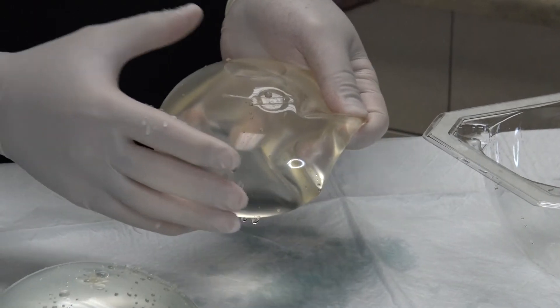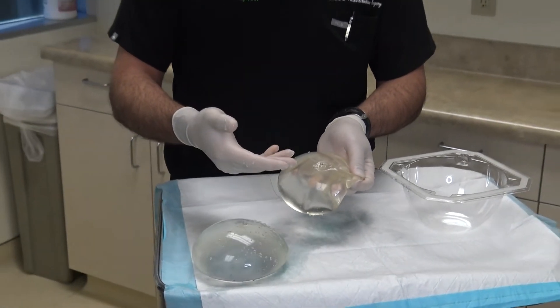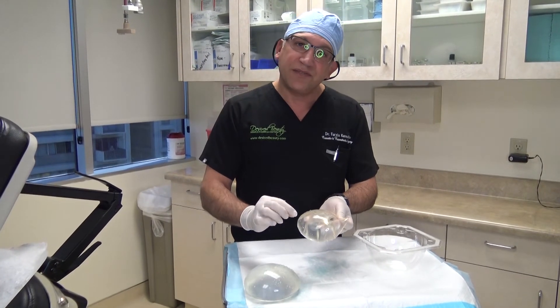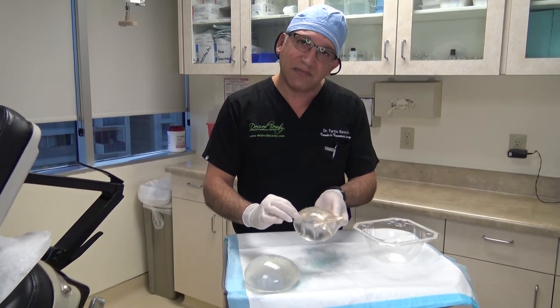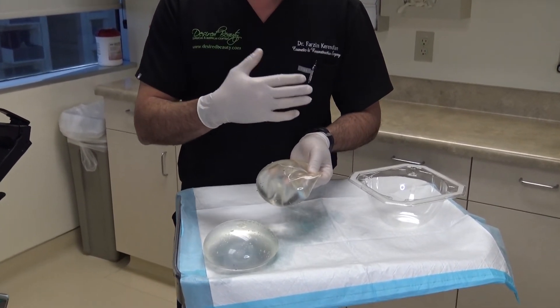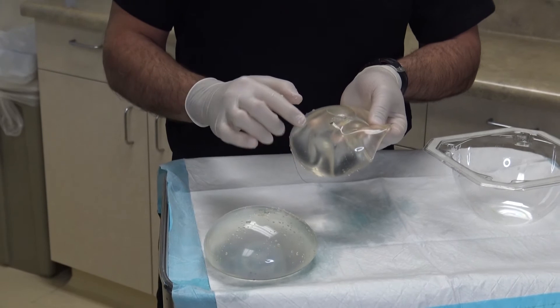Basically, the implant will stay at that reduced size, but it's something that needs repair. If there is a large rupture on the shell of the implant, in those cases patients will see within a matter of a day or two that the entire implant goes flat.